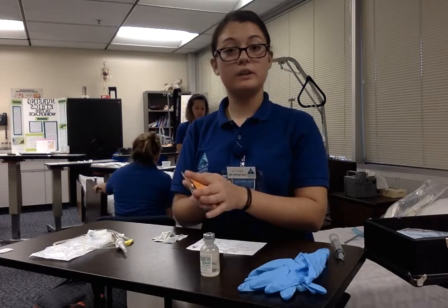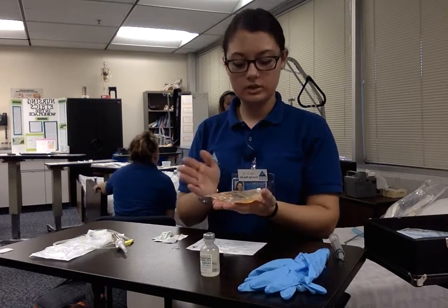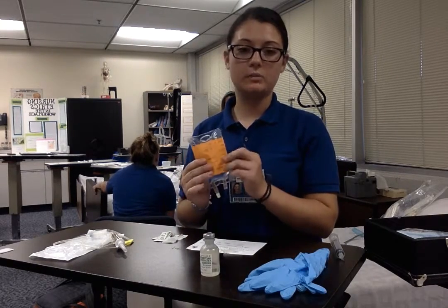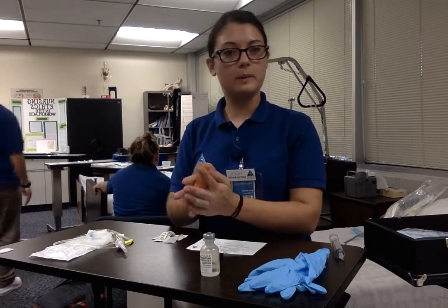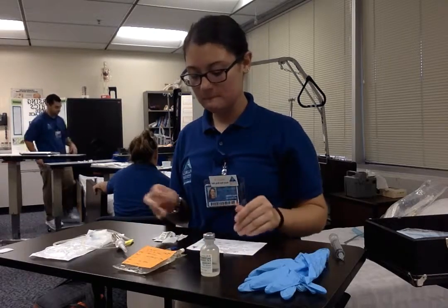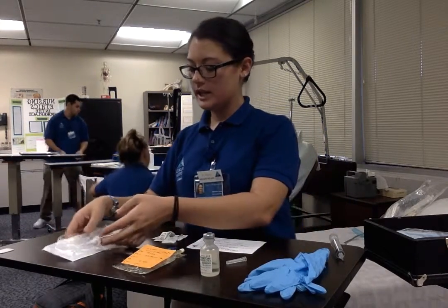Oh, that's another thing. You want to make sure that whatever drug that your doctor orders, it doesn't have a reaction with your normal saline or whatever's going to be in your bag, because obviously it would be bad. So we're going to make sure, and it's all good. There's no reactions. So that's together. And again, I have all my stuff. I'm going to go ahead and bring all these.